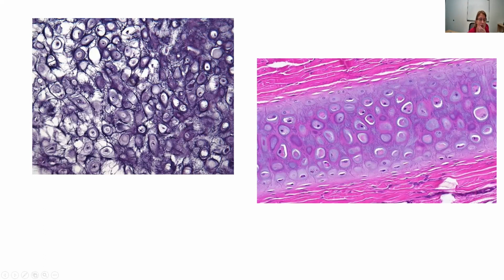So when I look at this one, it might be tempting to call it reticular or maybe even call it elastic because I see all these really dark lines. But these big circular openings, those are the lacunae. That tells me this is either bone or cartilage. And since I don't see the osteons of bone, I'm going with cartilage. So now how do I tell what it is? Well, if I look in the matrix, if I look between the lacunae, I have all these dark fibers. Over here, it's a little bit messier, but those are dark fibers that you can see in that matrix.